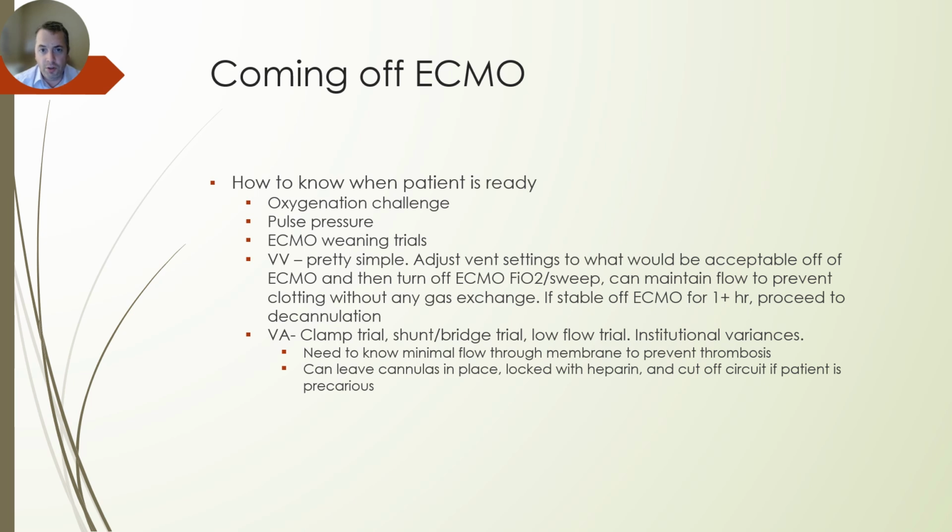And if there's a question about whether the decannulation is a little dicey, you can also leave the cannulas in place locked with heparin and remove the circuit and leave those cannulas there, so that recannulation would not involve a redissection and recannulation of the same, much more fragile vessels.